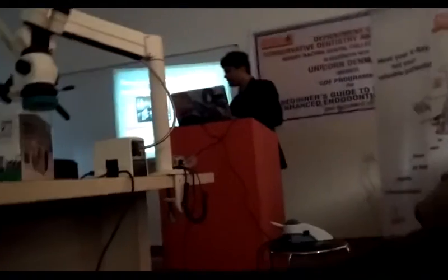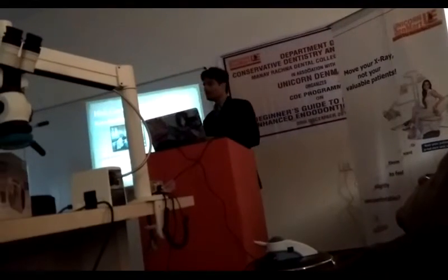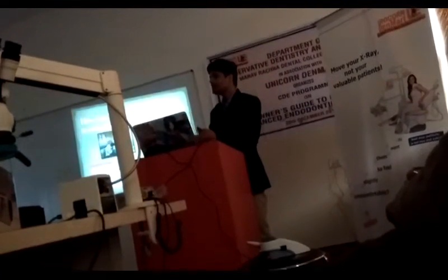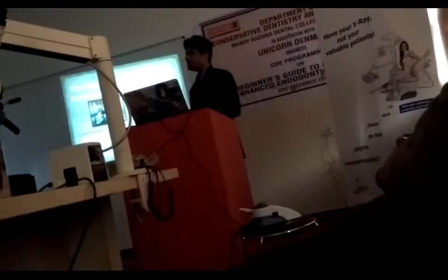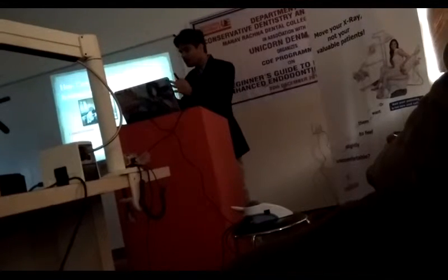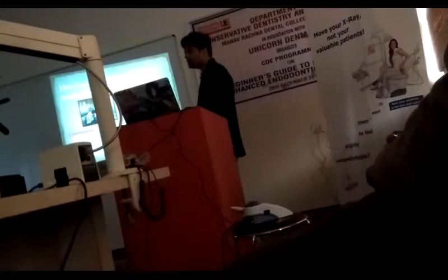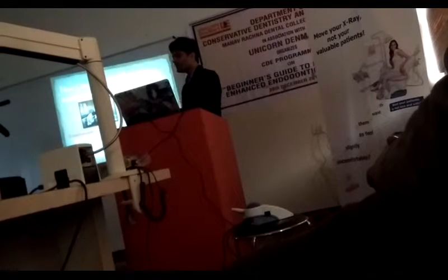As you move closer, the depth of field will decrease. It means either you will focus more on the palatal canal, or you will focus more on the mesiobuccal or the distal canal. So ultimately, with the help of a microscope, when you increase the magnification from 2x up to 16 or 20x, you can focus only on the palatal canal or the mesiobuccal canal or the distal canal. Hence, the depth of field will decrease as the focal length decreases.